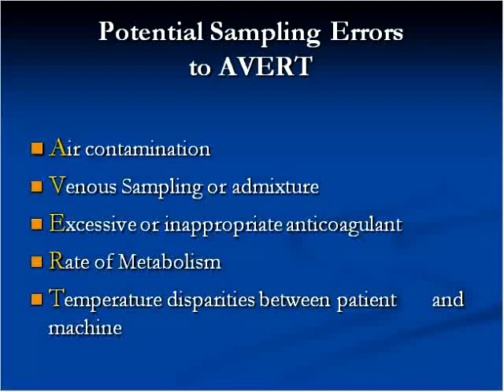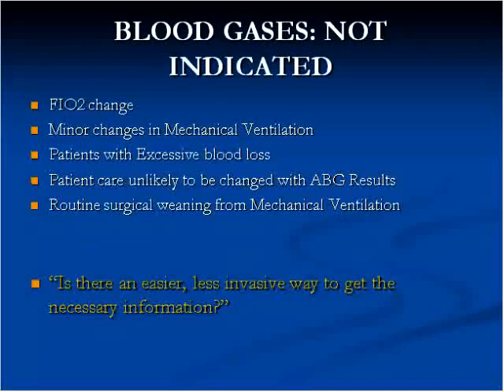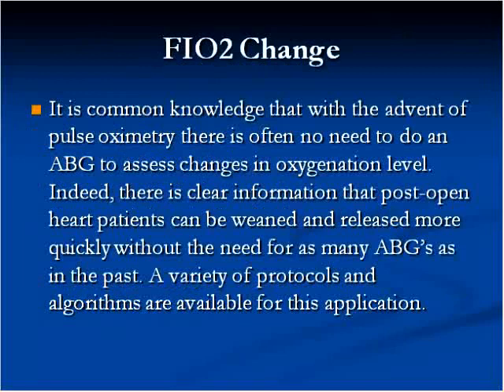And there have been some of my favorite blood gas cases where people have demonstrated extreme, what they call pseudo-hypoxemia. The term leukocyte larceny has also been used, but those are some things you would want to keep in mind for best practice of drawing blood gases technique-wise.